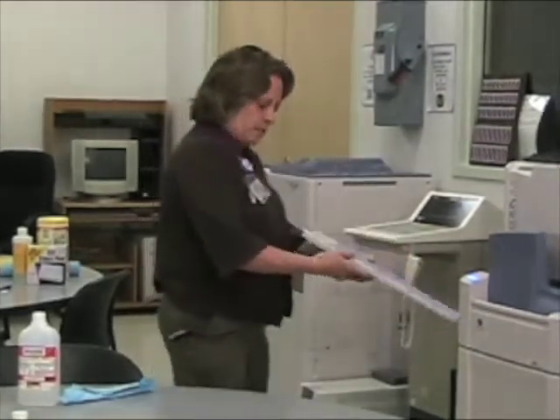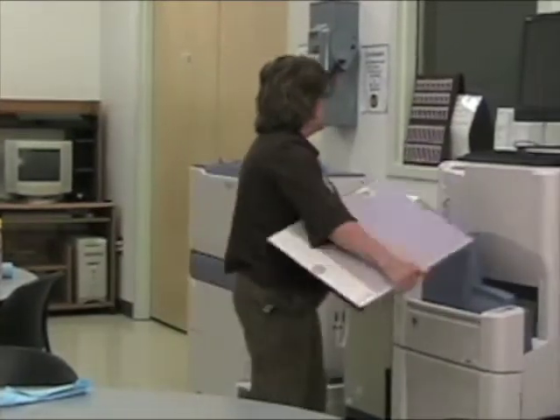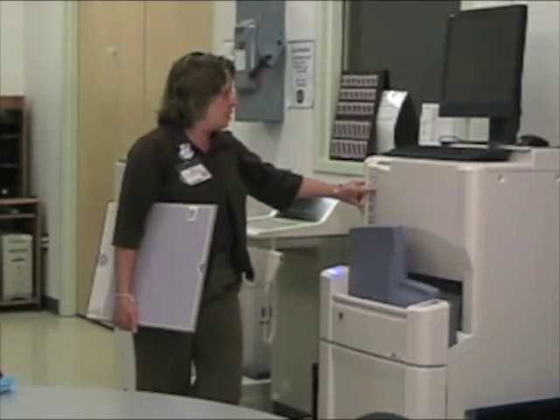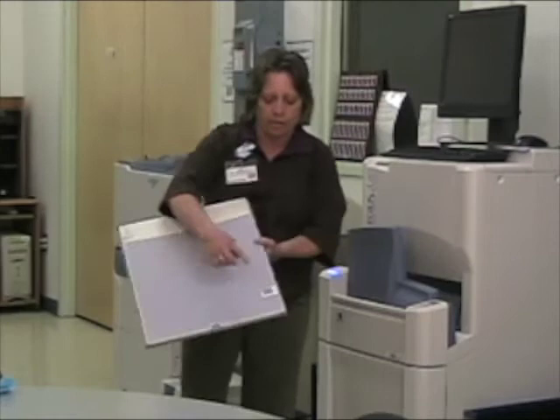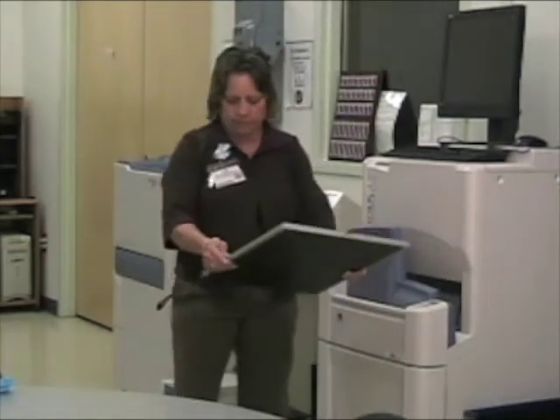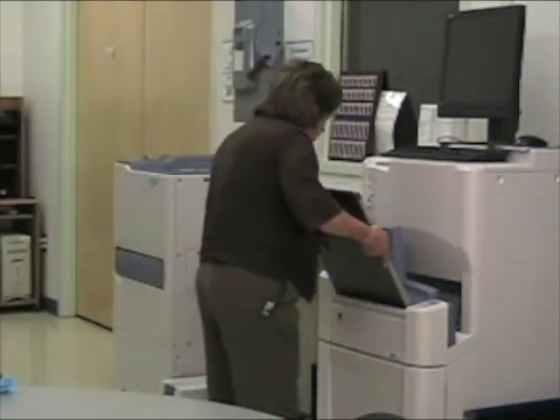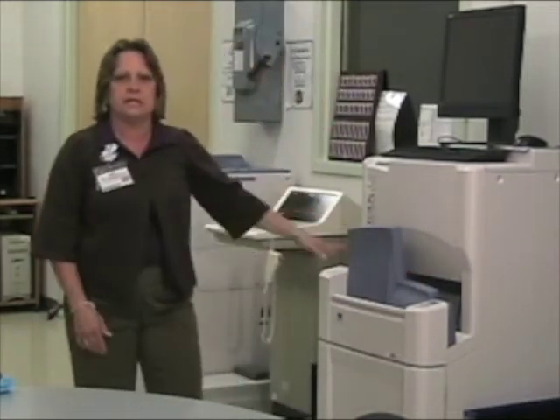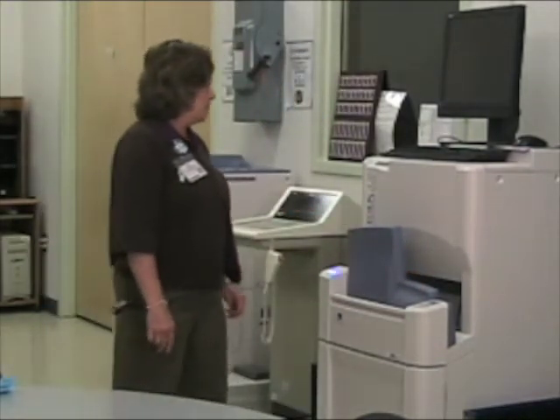Then bring it over to the image reader. Push the erase button and hold it in. Make sure that your barcode is facing down and just put it on the reader. This will give it a deep erase. It's a little bit noisy when you're erasing. That way you make sure that all the radiation from the lights are erased off your cassette.